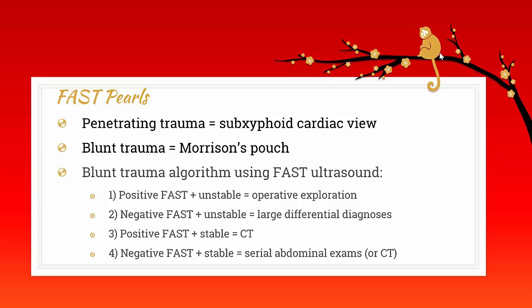So if you have a positive FAST exam and an unstable patient, they need to go to the OR. The only right answer is operative exploration. If you have a negative FAST exam but an unstable patient, you have a large differential diagnosis and you need to do some more testing quickly, but are also likely going to need a trauma surgeon consult. If you have a positive FAST exam plus a stable patient, these people can go to CT with close monitoring because you want to further delineate those injuries.